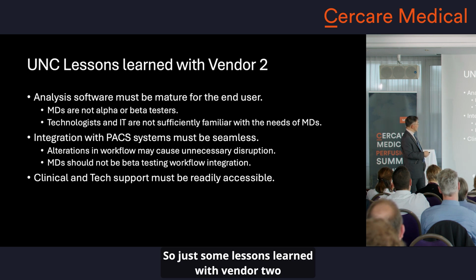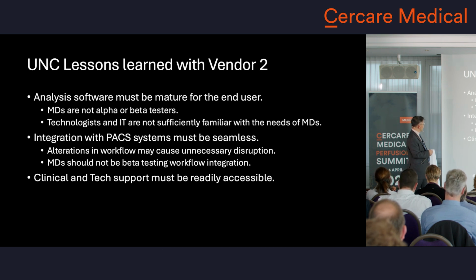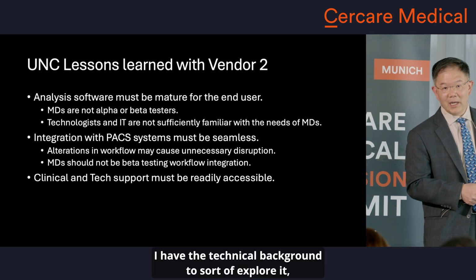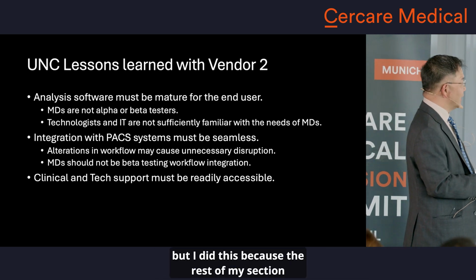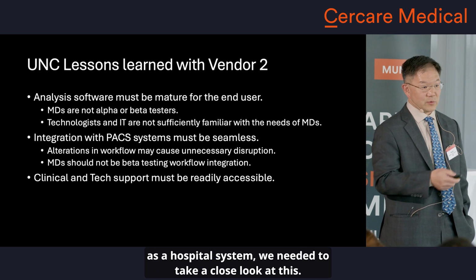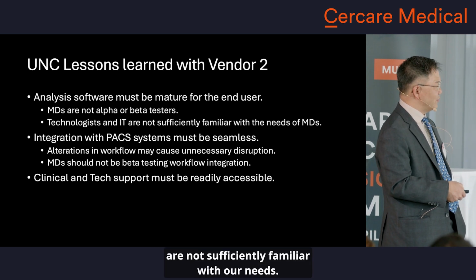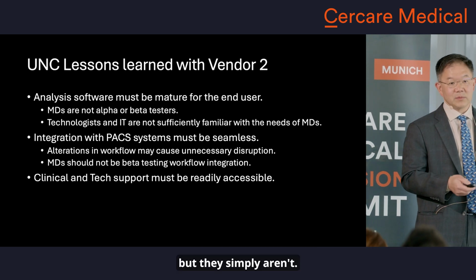So just some lessons learned with vendor 2 that you might take, be you a vendor or be you an end user. Please don't let the MDs be the alpha or beta testers. I have the technical background to explore it, but I did this because the rest of my section was not interested in doing this. And unfortunately, if we were going to evaluate this as a hospital system, we needed to take a close look at this. Our technologists in IT are not sufficiently familiar with our needs. I mean, it seems obvious for me to say it out loud, but they simply aren't.